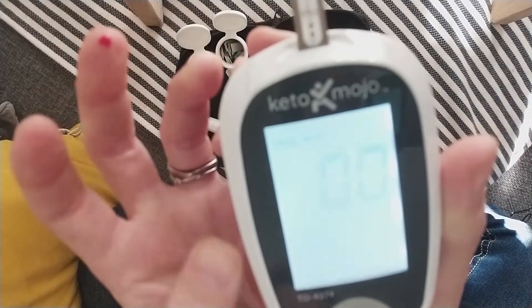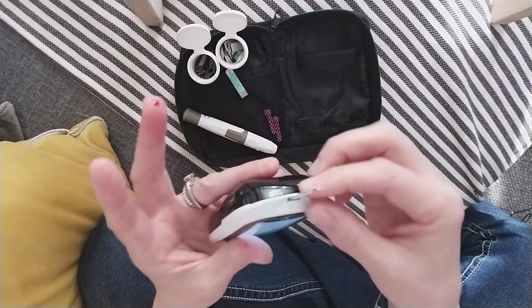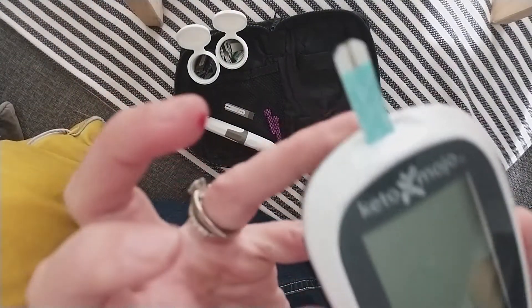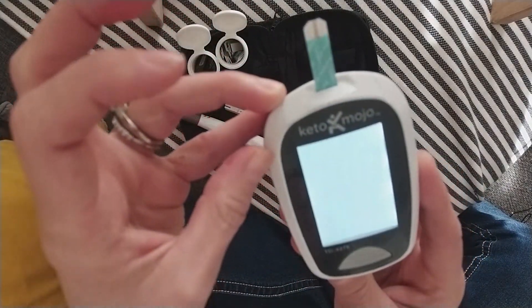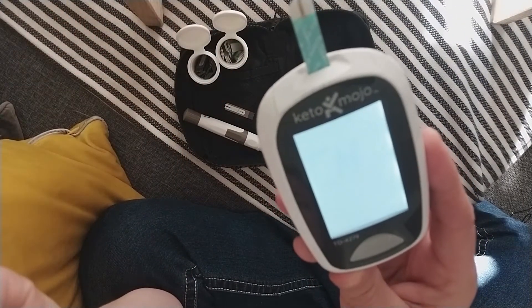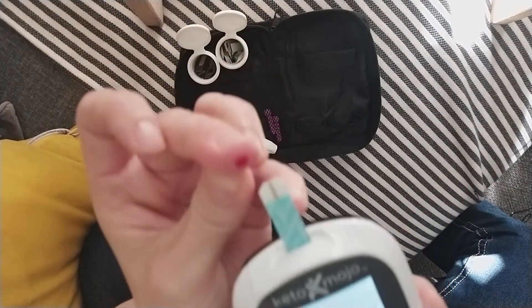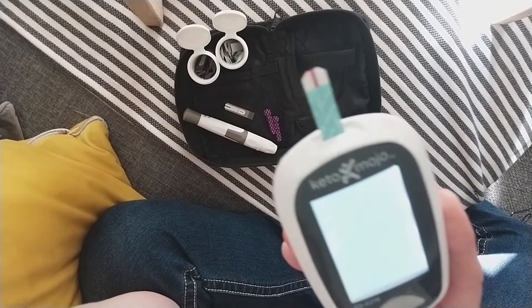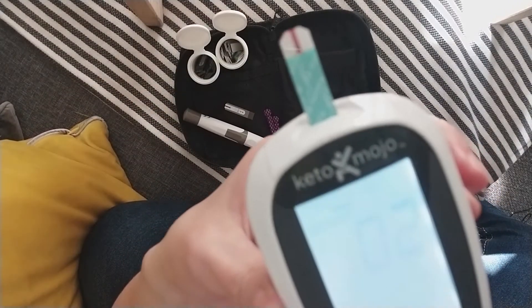You'll need about five seconds to get your results. Results will be saved in the Keto-Mojo. Just insert a new strip to take ketones — inserting will power on the monitor. Here again we wait until we see the blood drop letting us know it's ready to use, and then touch the tip of the ketone strip to the blood drop. Ten-second countdown this time to get our results.